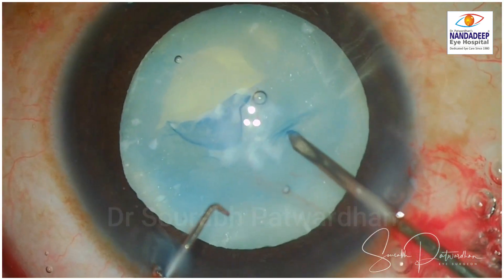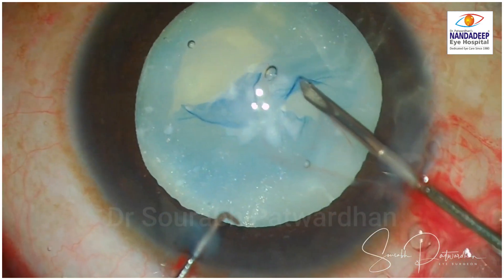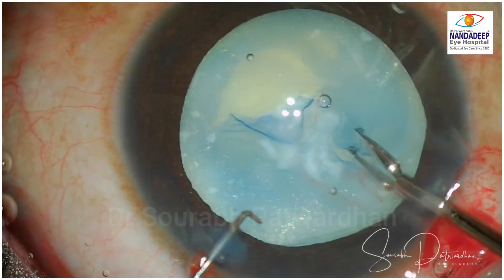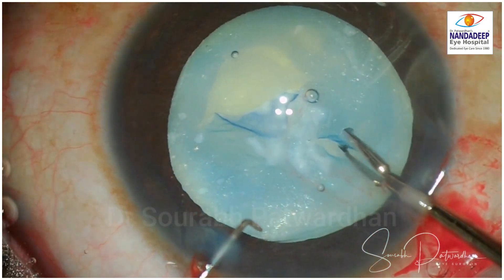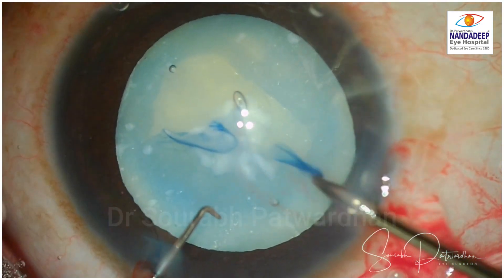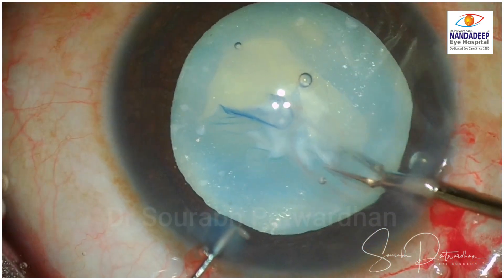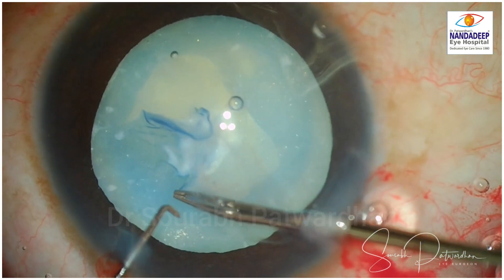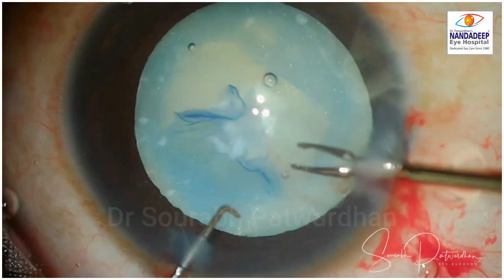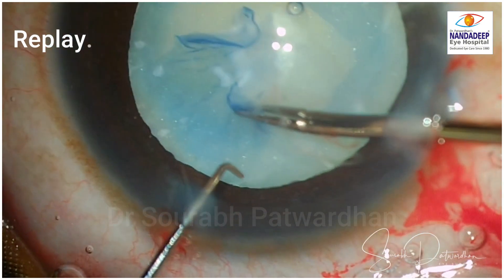What I did next was try to start the capsulorhexis from another area. That is one more technique — you start the rexis from another area to get a better approach. Here again you can see this area also has fibrosis. I am stretching the zonules a little bit and I could get a tear there, but in this area I cannot proceed, so I planned to do it from the other direction. To a certain extent I could pull it, but you can see the pull on the zonules was far greater.